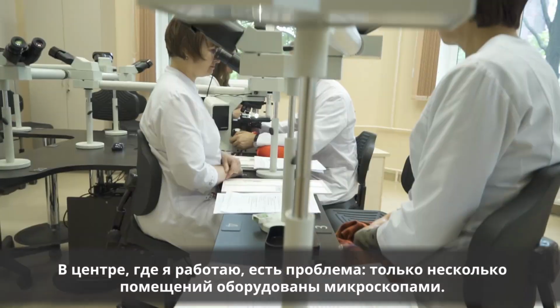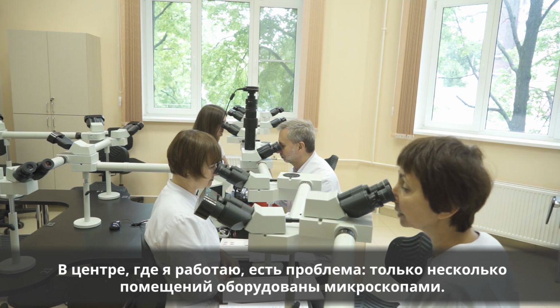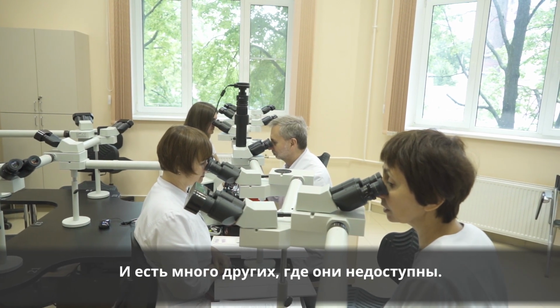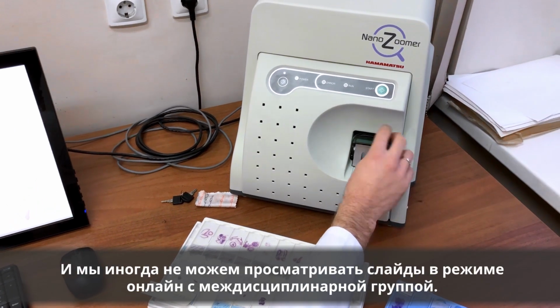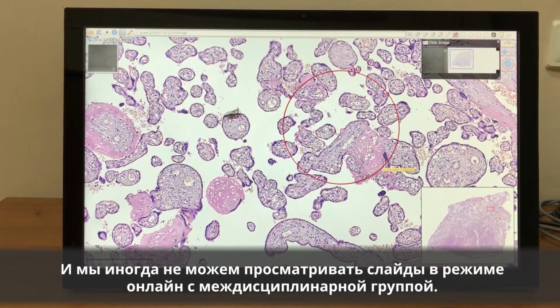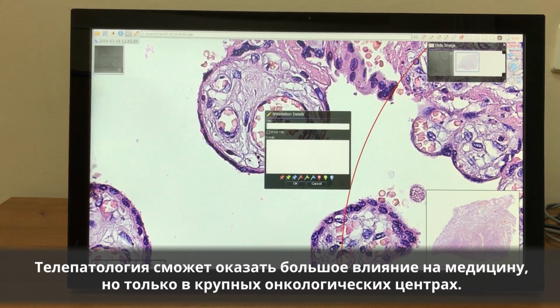We often have that problem at the Dana-Farber Cancer Center where I work: we have a few rooms with microscopes, but many others where they're not available, and we sometimes are not able to review the slides live with the multidisciplinary group. So I think digital pathology will have a huge impact on that, probably at all major cancers. It'll just take some time before that's implemented.